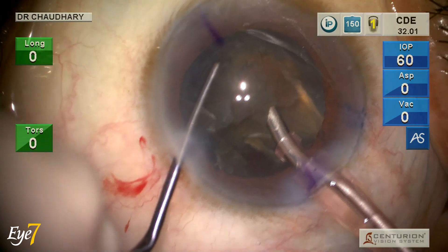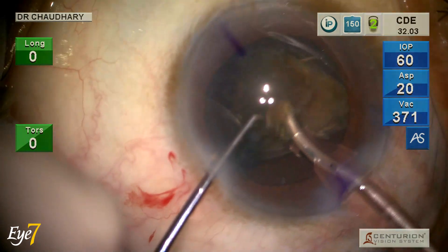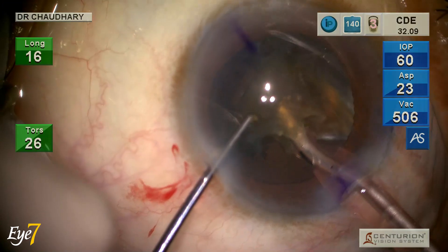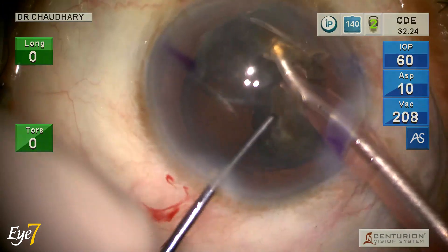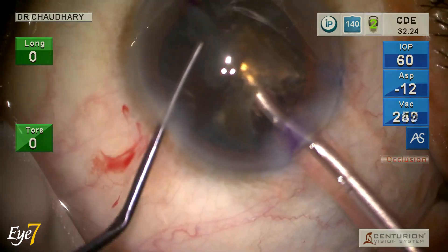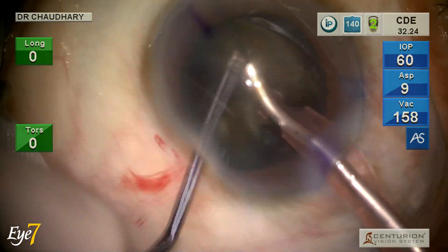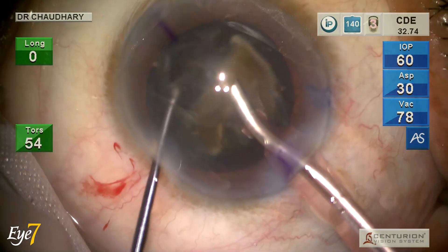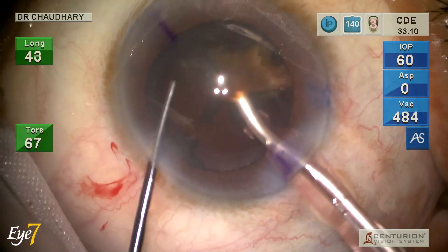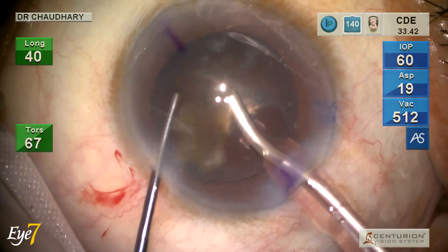With Active Sentry: Active Sentry means the IOP sensor is not in the phaco machine but in the phaco handpiece. Therefore, changes in IOP are sensed much earlier, the response time is faster, and the chamber is more stable.